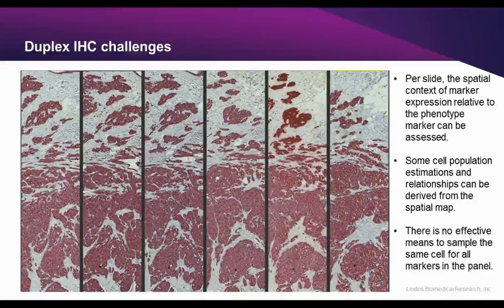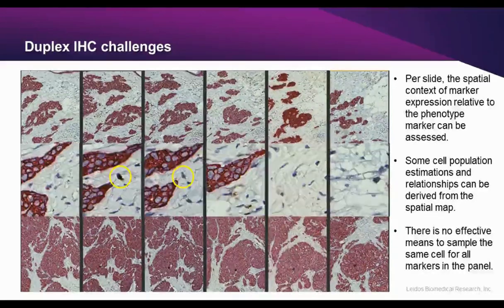Here is the same registered image stack up close. While the sections are fairly close, they are not perfect. At close inspection, we can see a different population of cells being sampled with each section. Though it appears at least two sections have the same cell being representative, by far most of them are not being sampled twice.